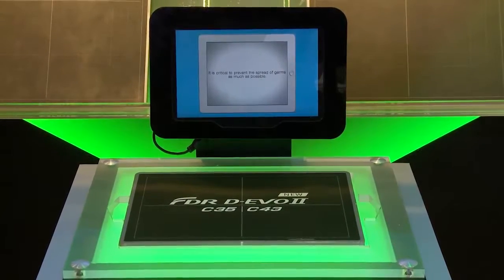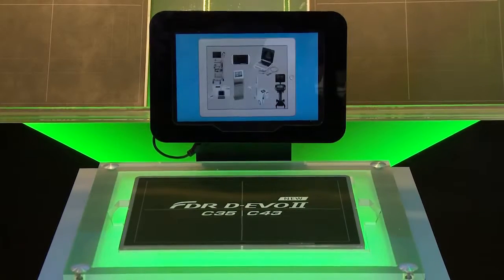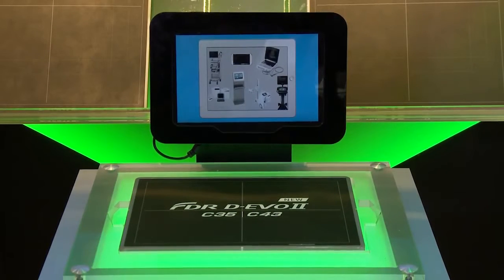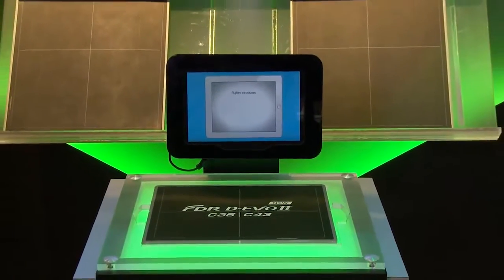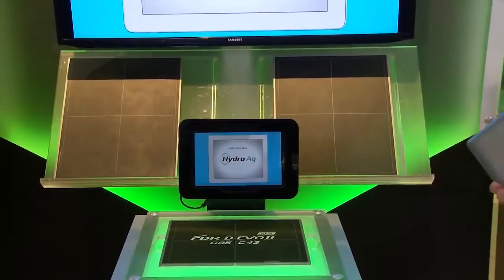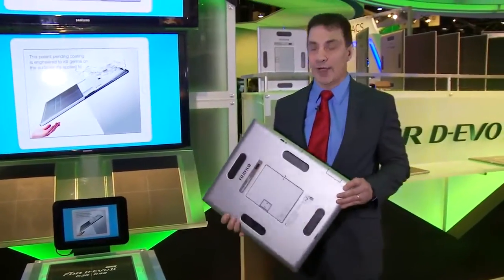I'm going to start out by showing you the latest DR detector in the industry. Once again, Fuji is bringing you the future of DR technology with our brand new detector, which is completely redesigned from the inside out. Everything about this detector has been redesigned for improved performance in every way.